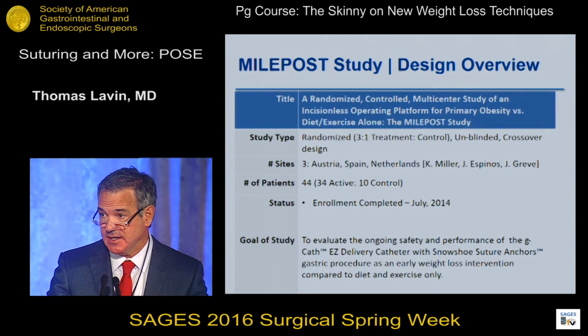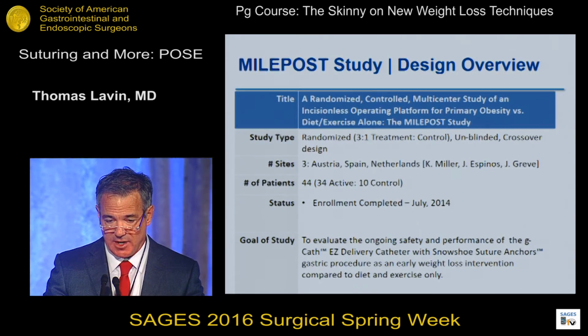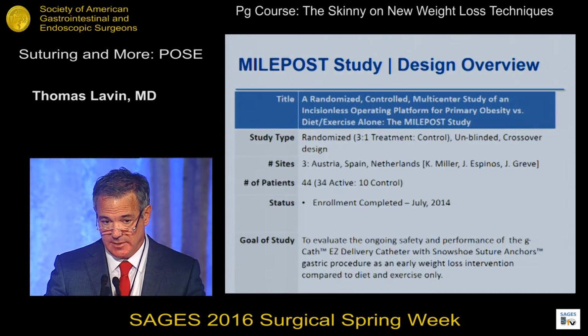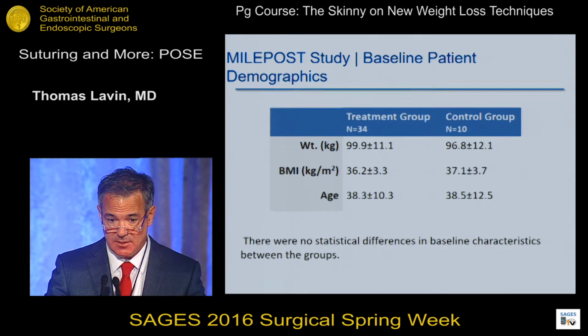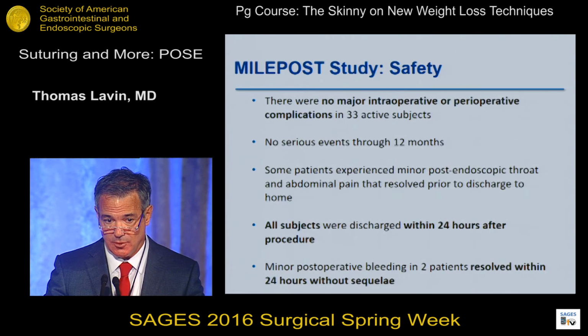The MILEPOST study is a multi-site, randomized, not blinded study in Europe that has not been published yet, but it is being evaluated for publication now. They had 44 patients. It was a 3-to-1 randomized trial. Once again, not blinded, so the patients knew whether they actually had the POSE or were just in the diet and exercise group, and it was really to evaluate the difference between the active and the diet and exercise group. The two groups were pretty much the same. Once again, 3-to-1 randomization: you had 34 in the treatment group and 10 in the control group.